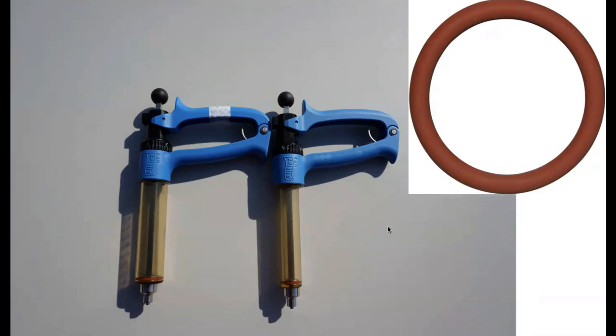What I've found is the ones that you have to tighten down, sometimes we have more issues with those leaking compared to this style. The other thing is sometimes people worry about, well, will that O-ring wear out over time and do I have to replace it? It is a good idea just to have a spare O-ring or two on hand. I will tell you though, if you maintain these syringes well and use the system I'm going to talk about cleaning later, I've never had to change the O-rings on the set that I use for personal use for giving vaccines. Now, the set that I haul around in the pickup that we use for demos, and not actually giving the vaccine, but just showing people and letting them play, I have had some of those O-rings split, but we'll kind of talk about those differences here in a minute.